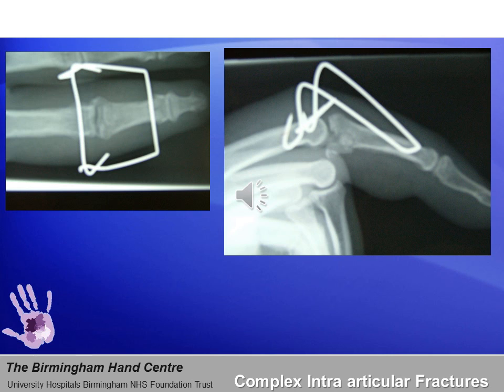Here is another case showing the Suzuki frame producing distraction of the proximal interphalangeal joint in a fracture dislocation, allowing for early mobilization. This is a closed procedure — there is no opening of the fracture. There is a defect in the chondral surface which will be filled by fibrocartilage, producing reasonably good results. I doubt that in less technically competent hands, open reduction internal fixation using, for example, a buttress plate on the volar surface would yield a more desirable outcome.